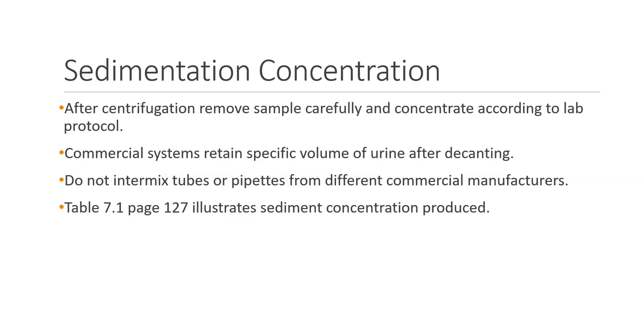Commercial systems will retain a specific volume of urine after decanting. Do not intermix tubes or pipettes from different commercial manufacturers because they are different.